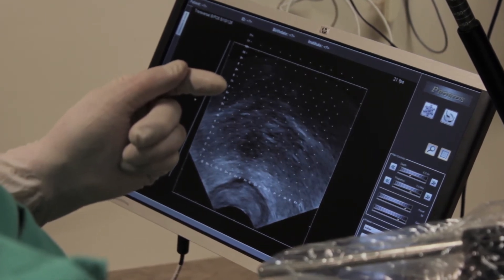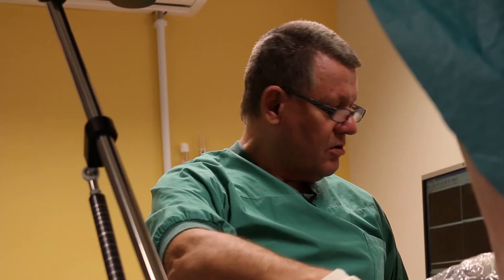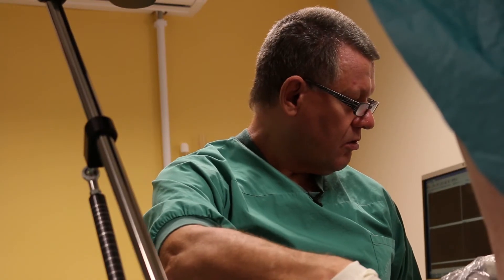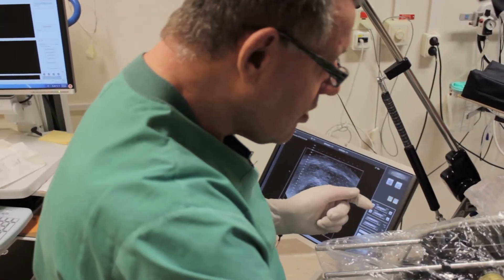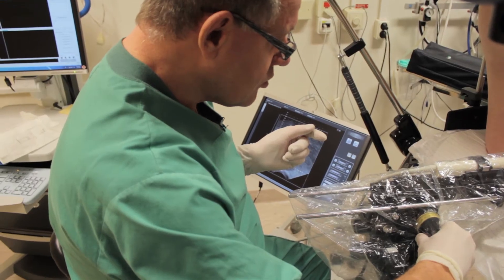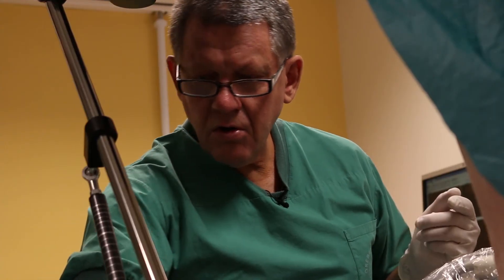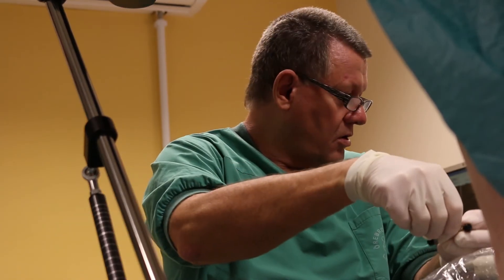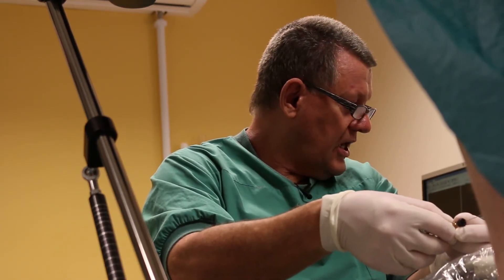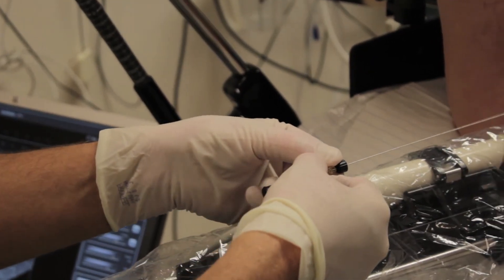Then I go back to the equator and put in the other marker. I will use the H2 position.